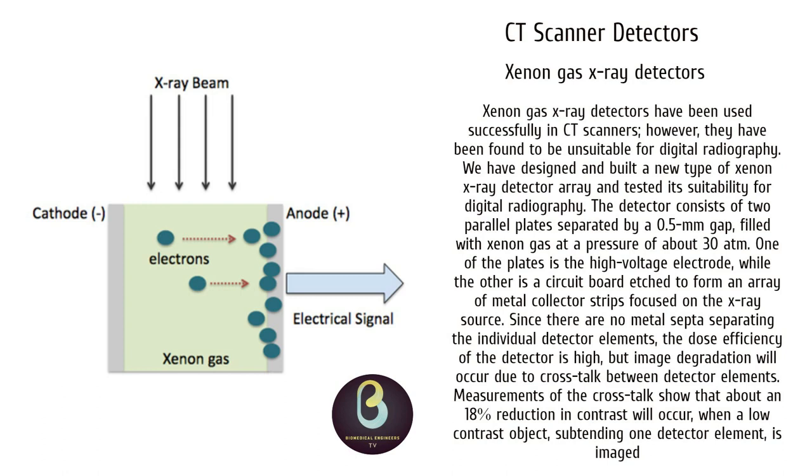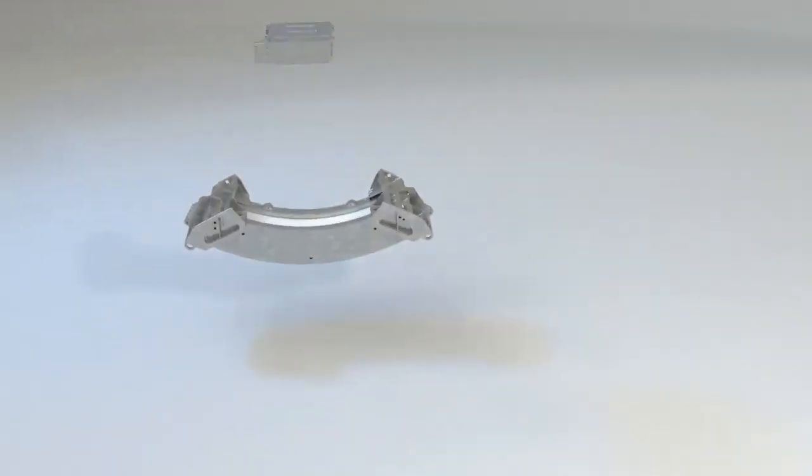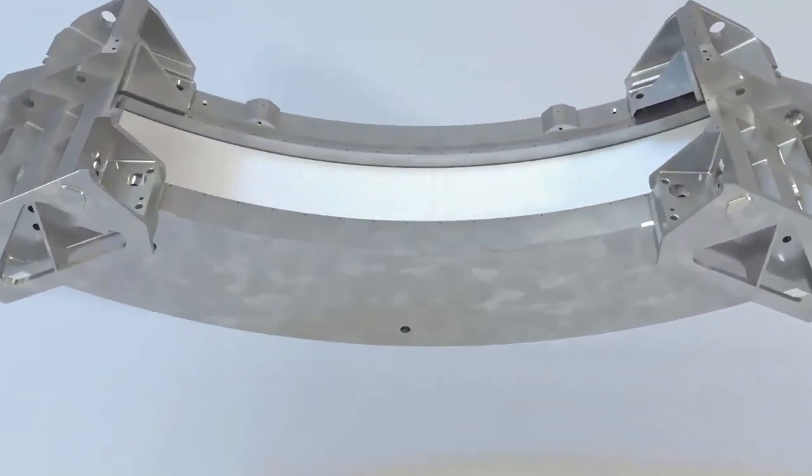First is a xenon gas detector. Pressurized xenon gas fills a hollow chamber to produce detectors that absorb approximately 60 to 87% of the photons that reach them. Xenon gas is used because of its ability to remain stable under pressure. Xenon gas is significantly less expensive compared with the solid-state variety. It is also somewhat easier to calibrate and is highly stable.